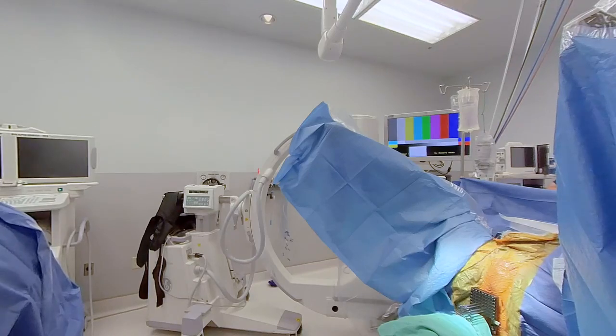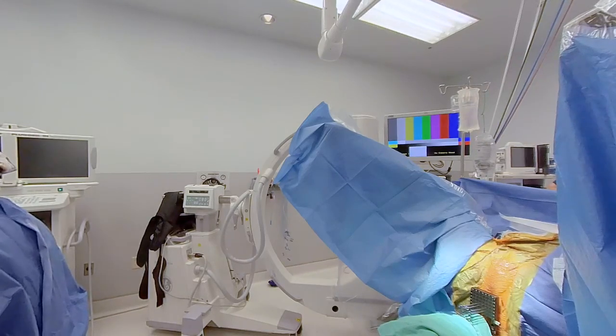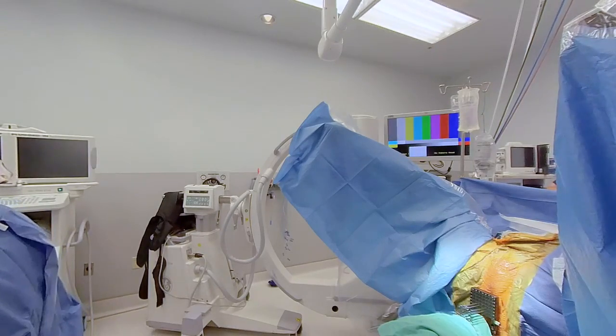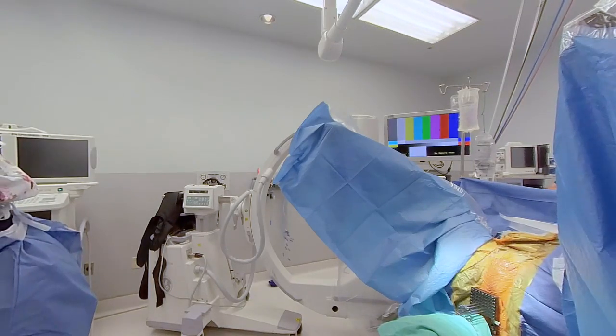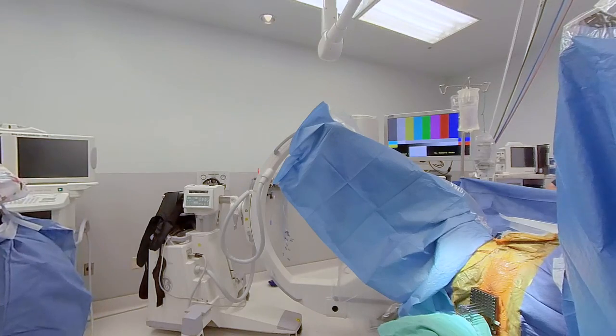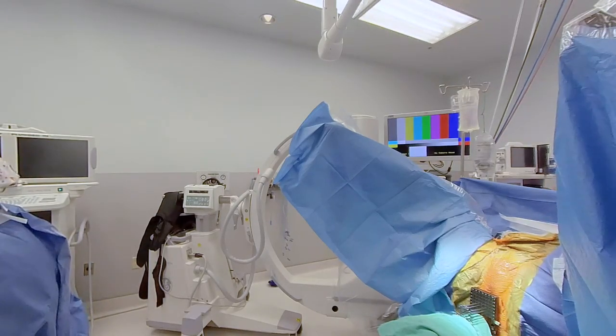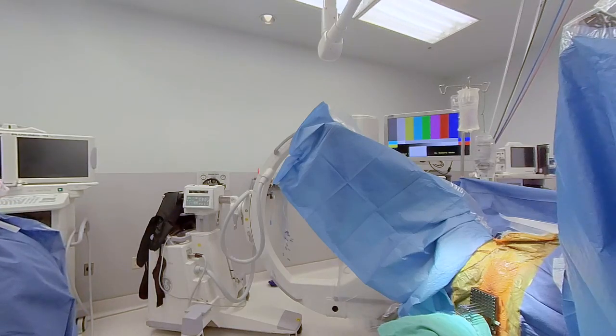So our D90 is 180. We like to be a little bit lower, somewhere around 170, or between 160 and 170. So we're going to cool that down a little bit. I try to limit the number of seeds in the middle of the gland.